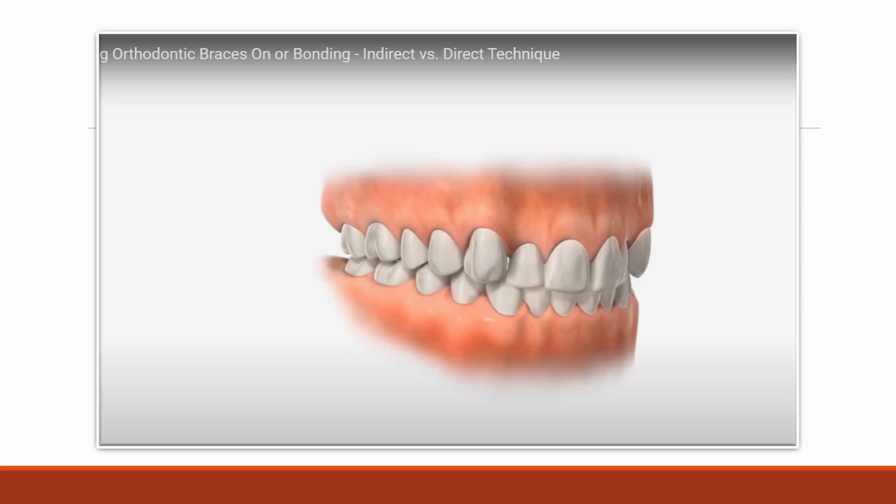Roth also placed a greater emphasis on functional occlusion and gave the canines greater tip to facilitate cuspal guidance. There was also greater torque in the maxillary molar region to prevent dropping of the palatal cusp and eliminate non-working side interferences.